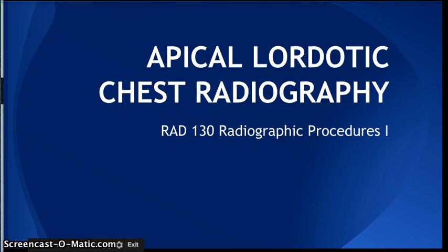Hello, this lesson is on apical lordotic chest radiography. When reviewing the evaluative criteria for a routine chest x-ray, you should remember that the entire lung fields must be demonstrated, from the apices of the lungs to the bases of the lungs. Although the entire lungs are demonstrated, the clavicles do angle downward slightly and obscure the apices of the lungs.